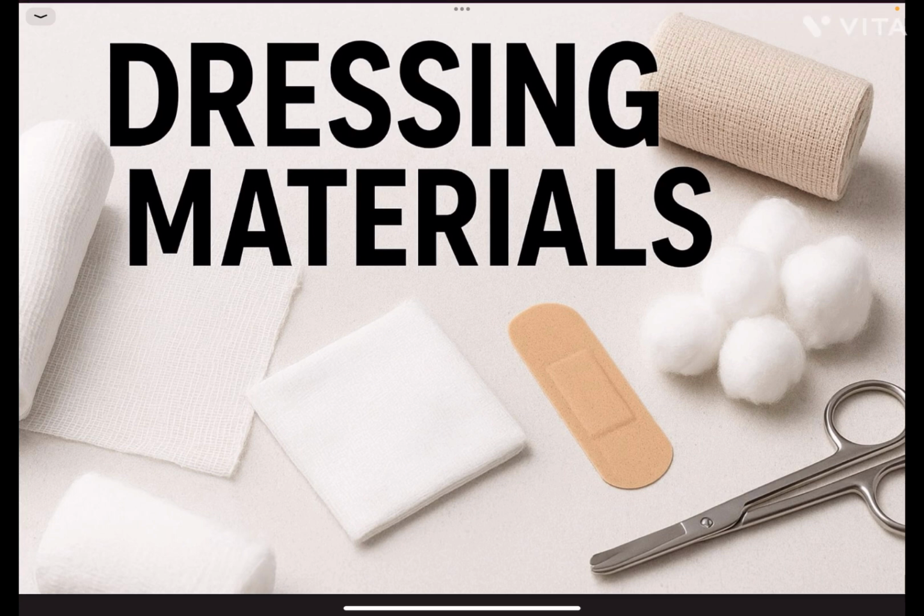Contact layer of the dressing is the one which we apply after application of dressing chemicals over the wound, like cotton gauze pieces kept directly over the wound. This is the contact layer.